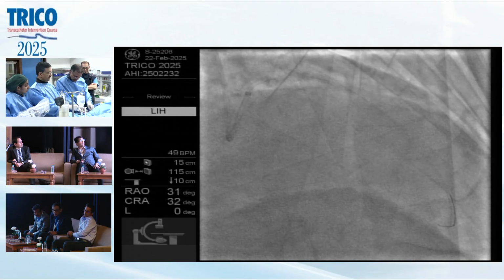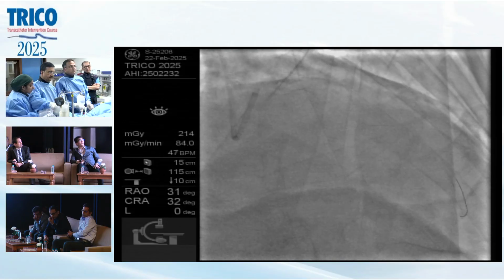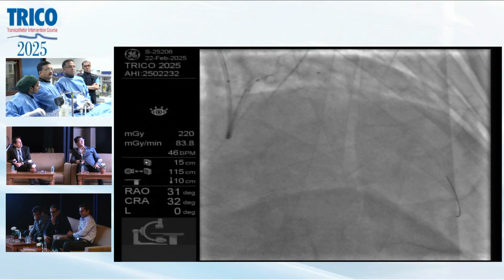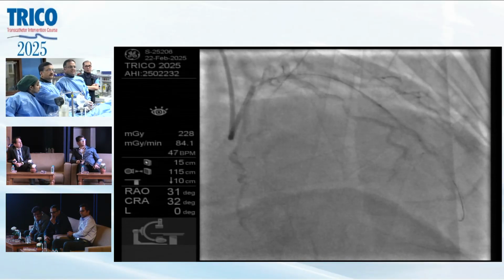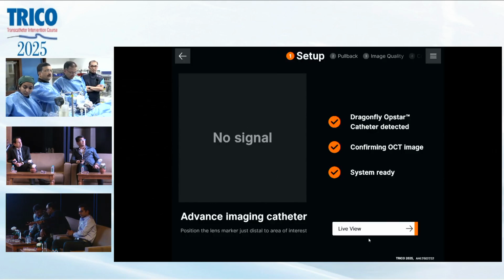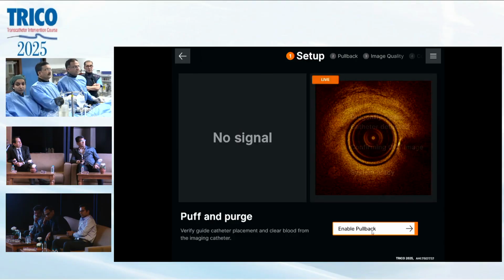Just stopping this thing. You can't do partial. But it's good, no partial was there. Let me bring it back a little. Too far down, so somewhere split the difference. Okay, around there. And the guide is good. Ready? Yes. Okay, that's good. Are we ready with OCT? Yes. Go.